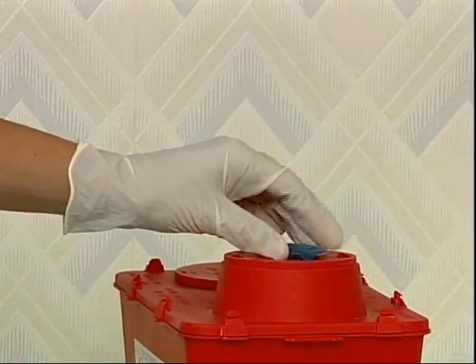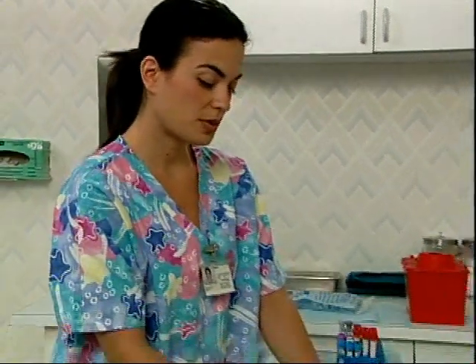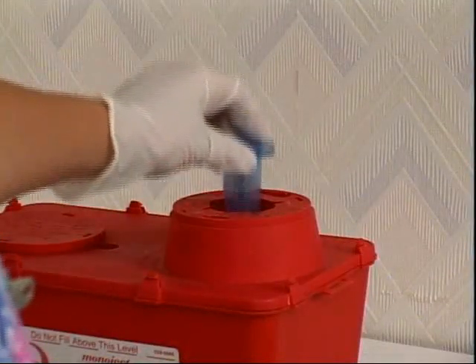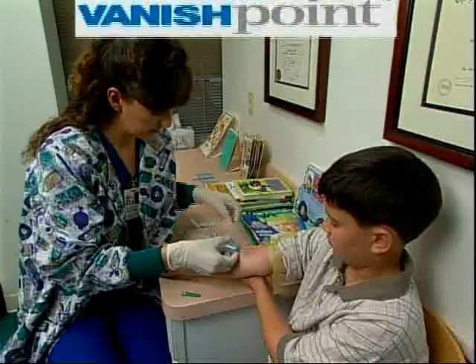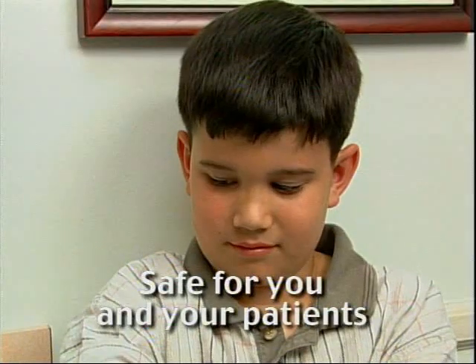Dispose of the VanishPoint tube holder in a sharps container in accordance with your facility's protocol. VanishPoint tube holders are single-use. VanishPoint tube holders allow for safe and efficient blood collection. VanishPoint — safe for you and your patients.